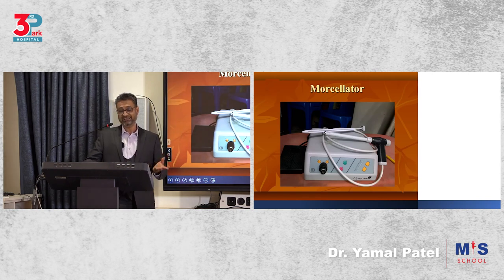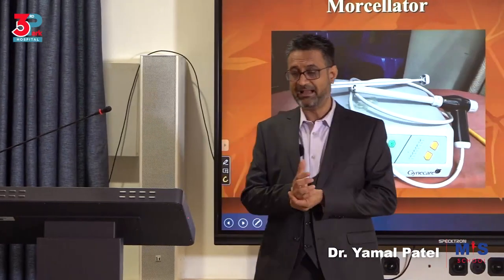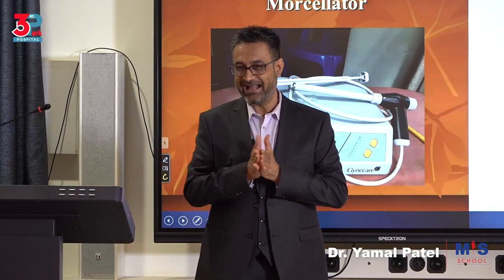We have the morcellator. I know there's been issues about morcellation, and it's been under caution. I wouldn't say banned. It's been under caution. It could be banned in the US. It's not banned here. I have done over 1,500 lap myomectomies.